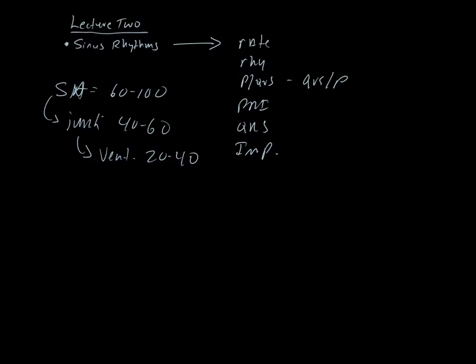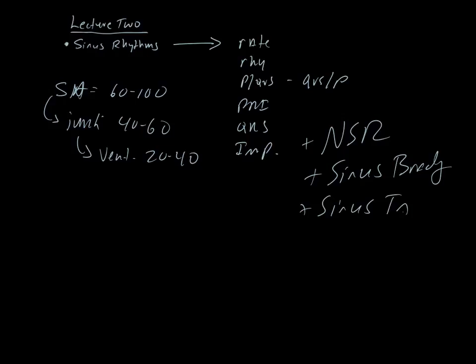Any questions over sinus rhythms? So you've got NSR, normal sinus rhythm. You've got sinus bradycardia that we talked about. We have sinus tach. And then we also have sinus arrhythmia or dysrhythmia. Any questions over any of those? Pretty standard. You guys okay with that?